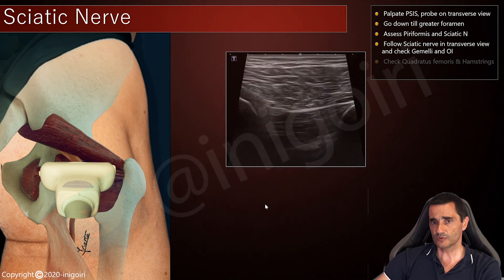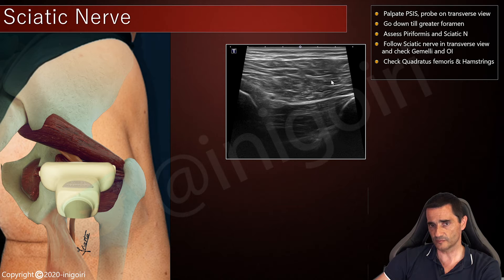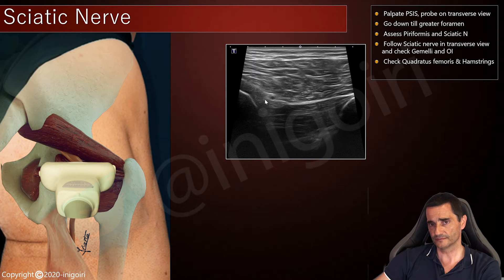As we continue distally, we follow the sciatic nerve and we will notice the quadratus femoris muscle below the gluteus maximus. This is the ischial tuberosity, and this is the most cranial portion of the hamstring's origin.